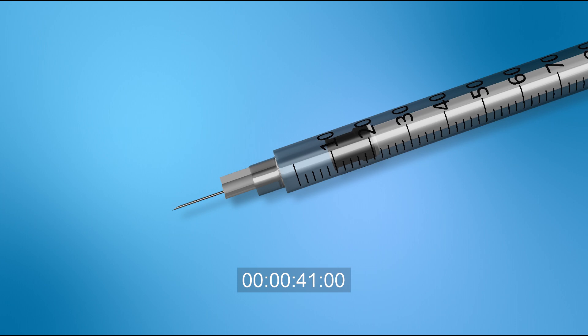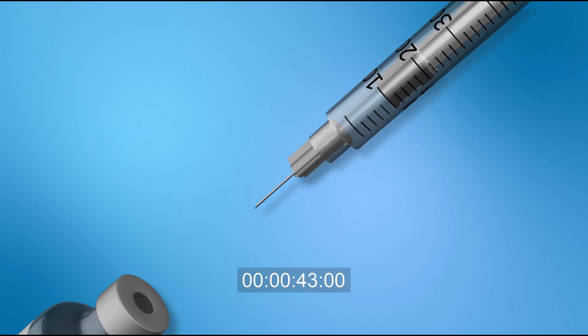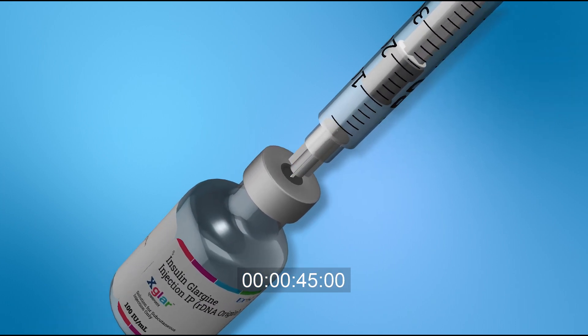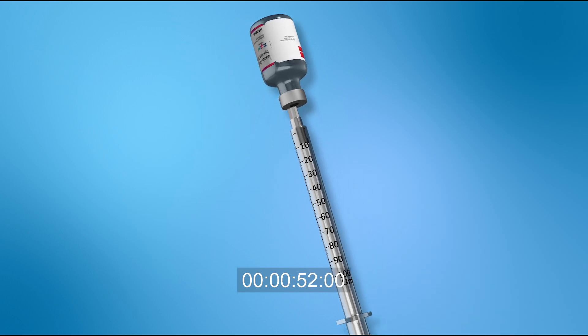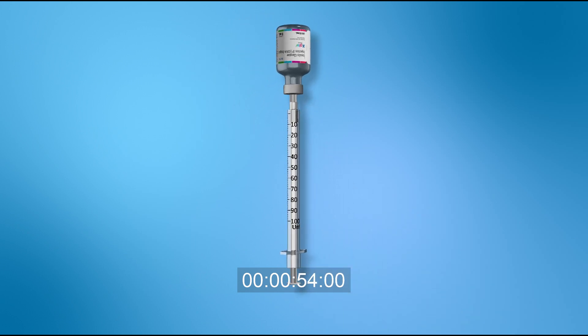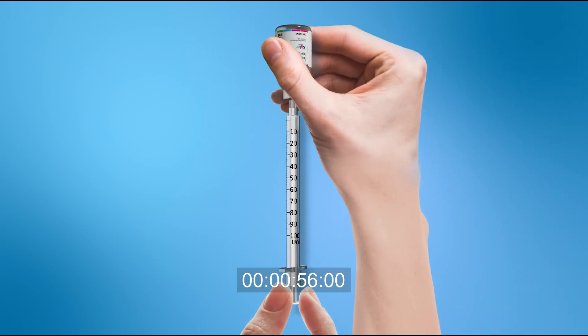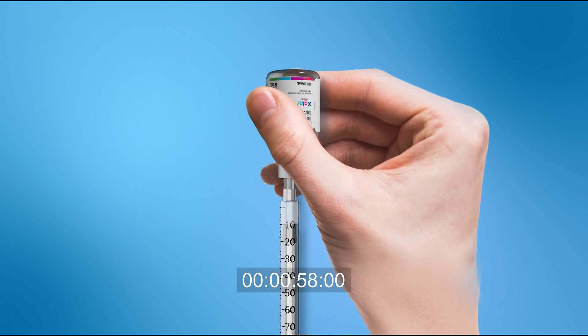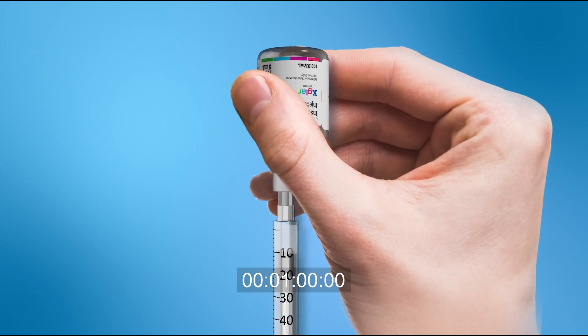Carefully take off the orange cap of needle. Insert the needle into the rubber top of the vial and push that amount of air into the vial. Turn both the vial and syringe into upside down position. Pull the plunger to withdraw the correct dose into the syringe.